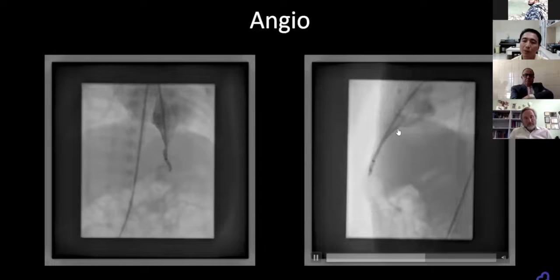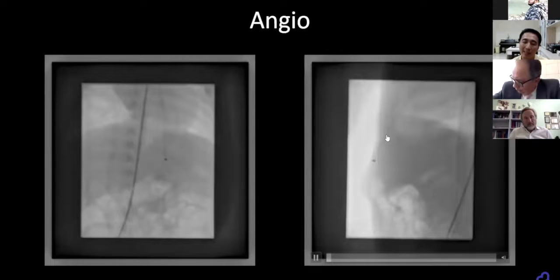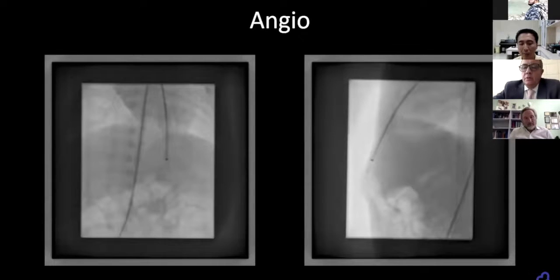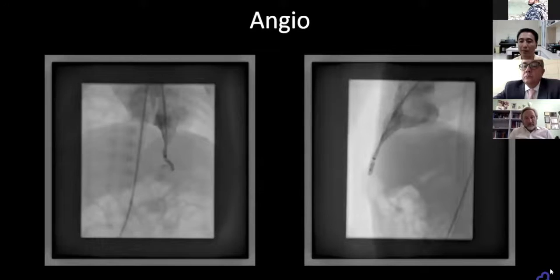So I want to put something that can occlude the LV apex area so that there is very little dead space that would carry a risk of thrombosis in future. An ADO device will fit, but then again, you cannot put it the other way around. That's where MFO comes in perfectly.